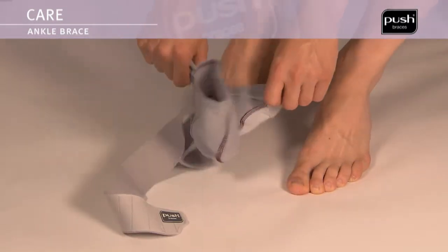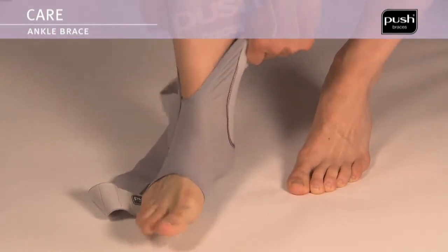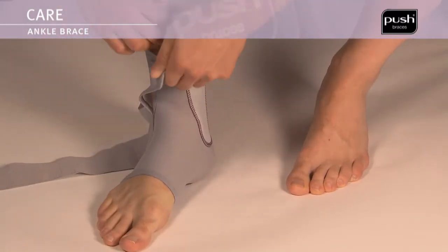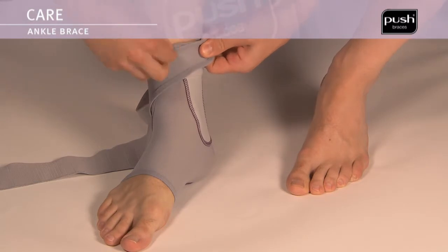Slide the base around your foot, making sure it fits snugly. Keep the foot at an angle of 90 degrees in relation to the lower leg. Then close the elastic fastening at the front.